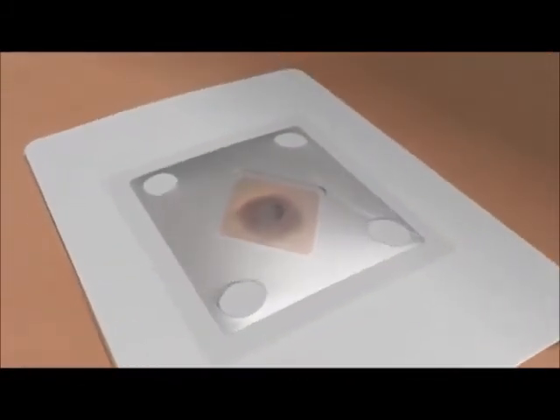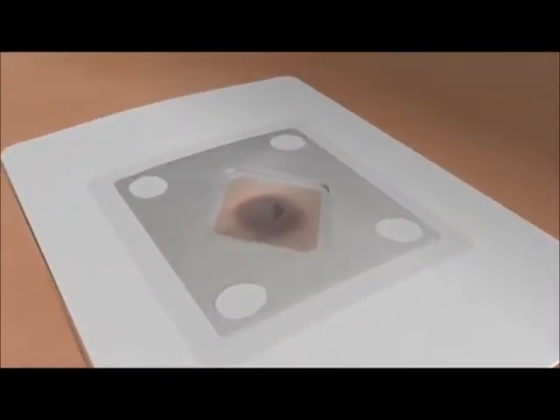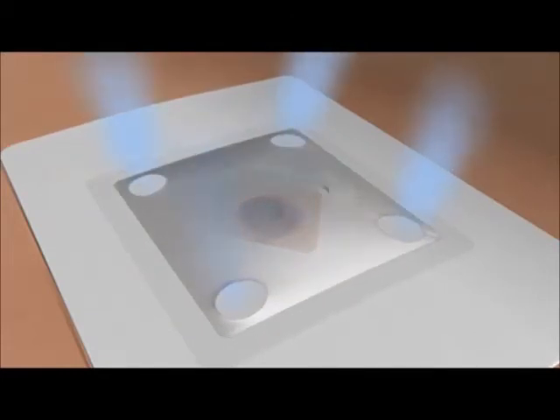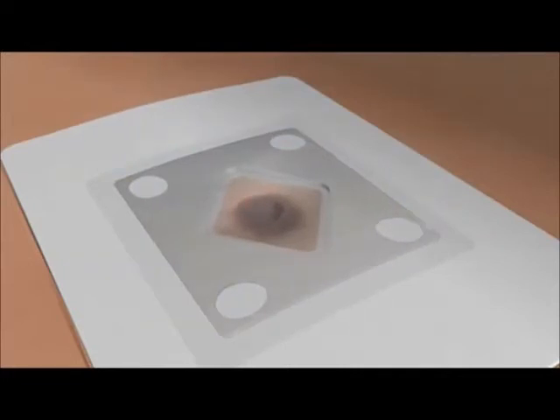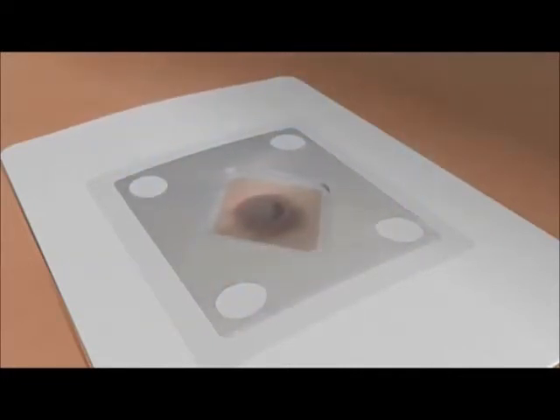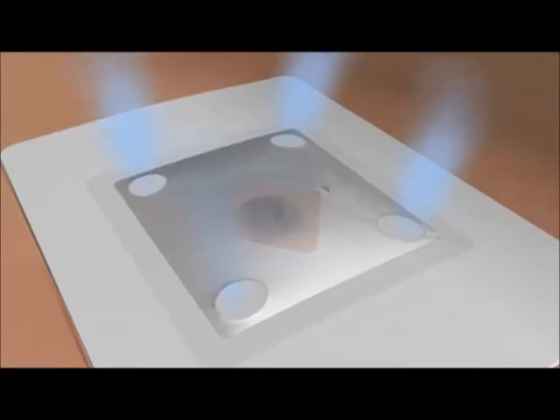It has a valve designed to open with a small positive pressure gradient and with sufficient capacity to allow a high flow of air and fluid to pass through it. 4 apertures allow this to happen efficiently and with minimal risk of obstruction. On inhalation, even a small negative pressure will make the valve close, even in the presence of fluids such as blood.